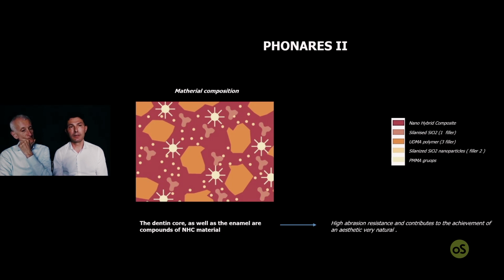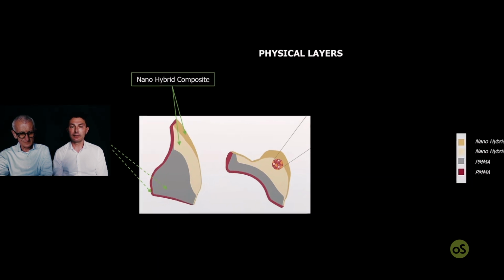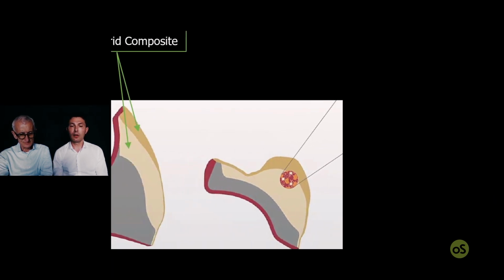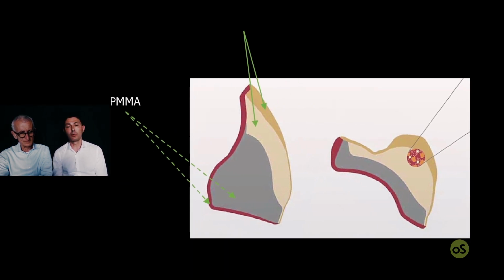Yes, it's not about the wearability resistance, but it's about the shape of the teeth. Because in the mold chart, you have a lot of different shapes, and I select the new teeth only respecting the shape, not the color or the wearability resistance, only the different shape.